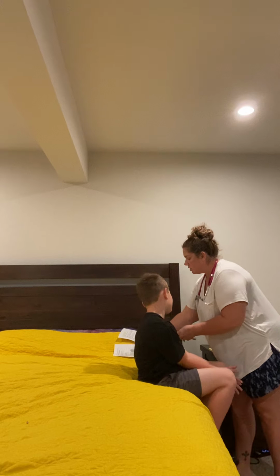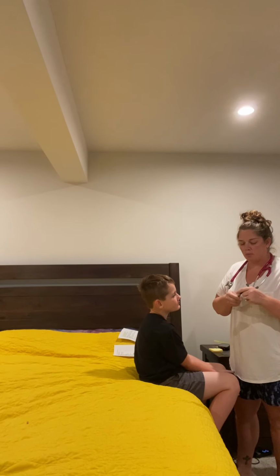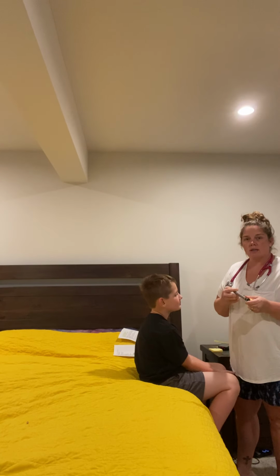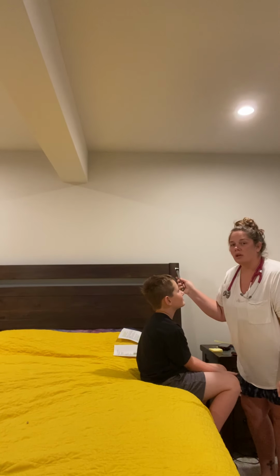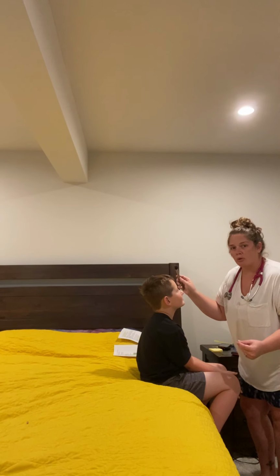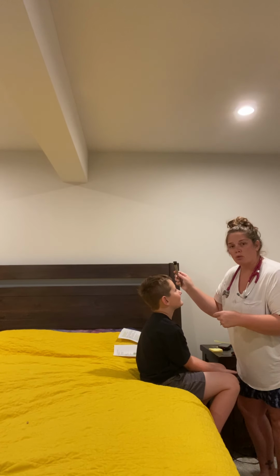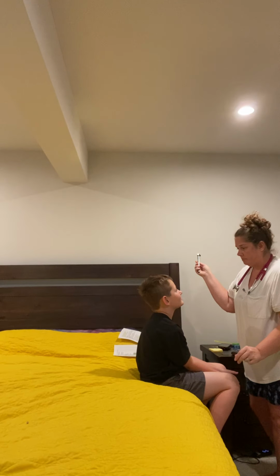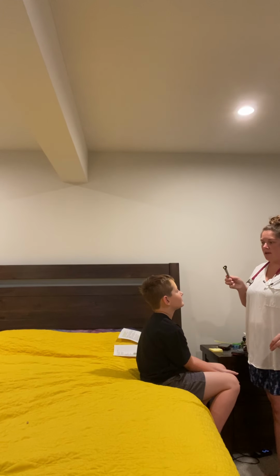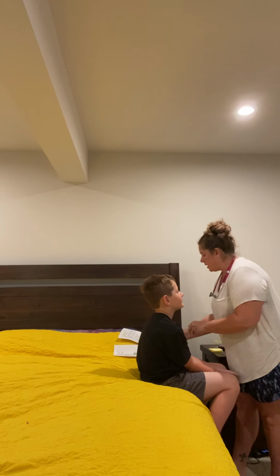Okay, so I'm going to go ahead and look into your eyes. I don't have an ophthalmoscope, so I'm just going to use my otoscope with the light and check his eyes that way. I'm looking at his red reflex to assess any kind of abnormalities with his retina, if there's any detachment, any kind of blastomas or anything like that. So what I do is shine the light from away and see if there's a red reflex. Look straight ahead. Okay, and his red reflex is positive.